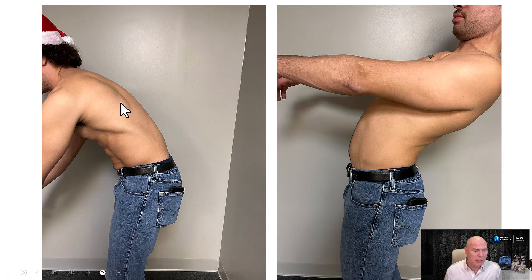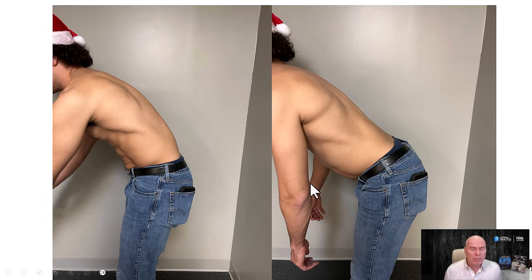When the patient flexes, you don't want them to flex at the hip — you want them to flex in the back, and you should see a C curve. Extension looks like this. The most common error that doctors make in positioning these images is the butt sticking out, hip rotation, with the flexion not being done in the lumbar spine.